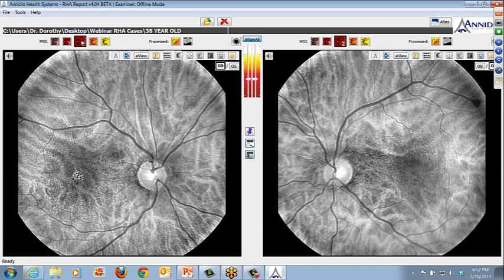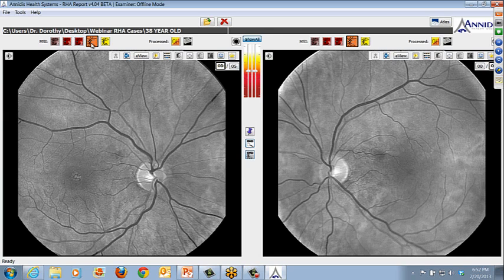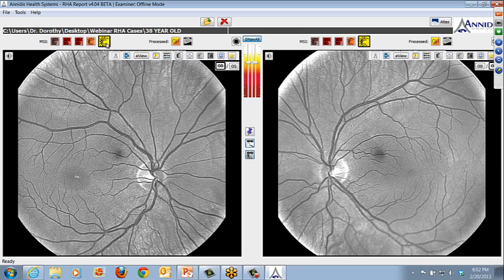And as you move away from the RPE, the atrophy will fade only because you're moving away from the RPE. So this is more of a traditional view. And, you know, it's quite a bit harder to see that there's anything wrong in this 38-year-old. You can certainly see that he has a blonde fundus. Just looking here, you can actually see the choroidal vasculature and see that, in fact, he has very low pigment reserves throughout his retina by makeup.